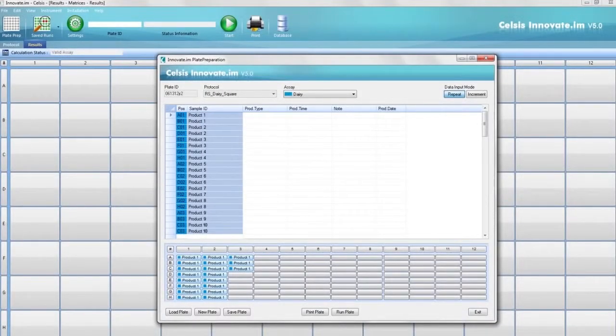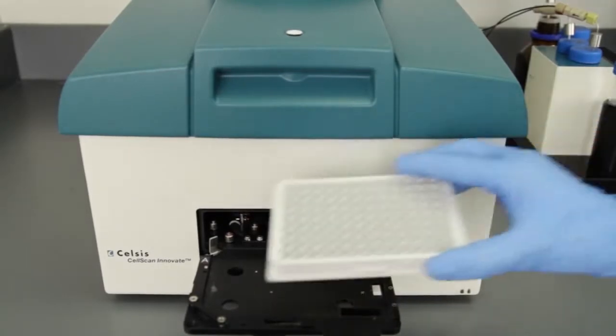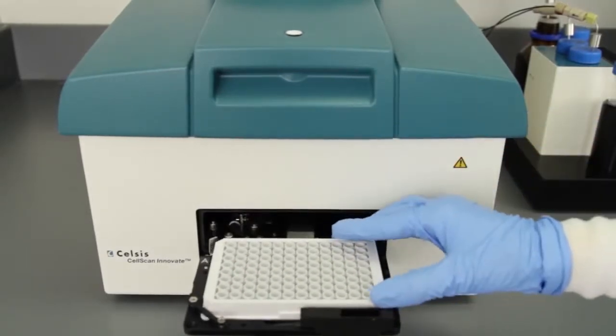Click Run Plate to measure, or Save Plate if you want to enter data for another plate before testing. Click Start to begin. The Innovate will automatically unload the plate carrier. Load your prepared plate and click OK.